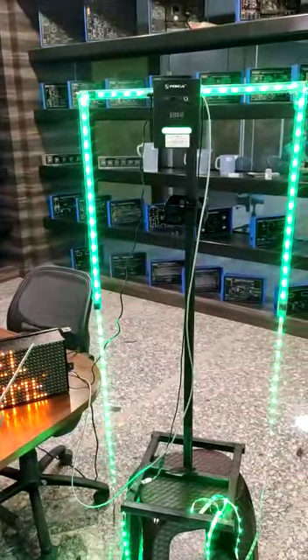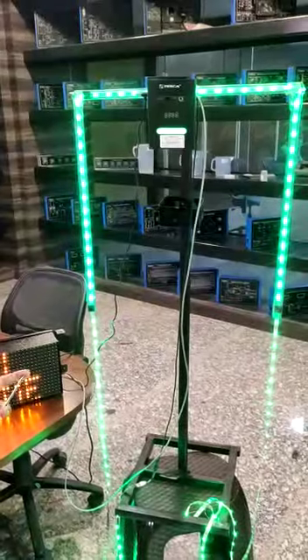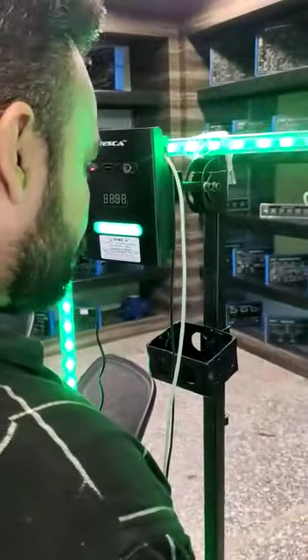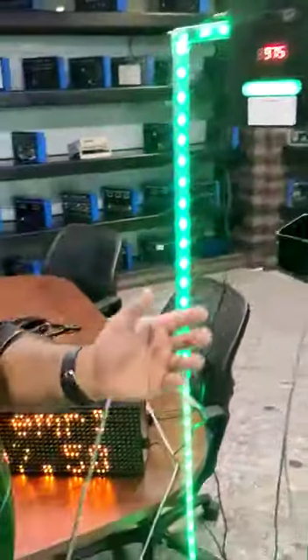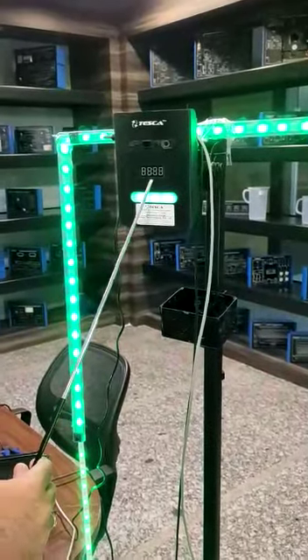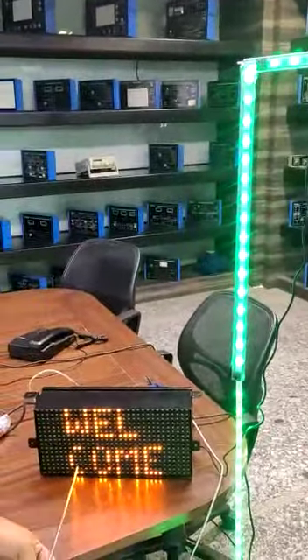So we perform the operation of this machine. As I reach the machine, it detects my body temperature which displays here on this 7-segment LED as well as on this board.